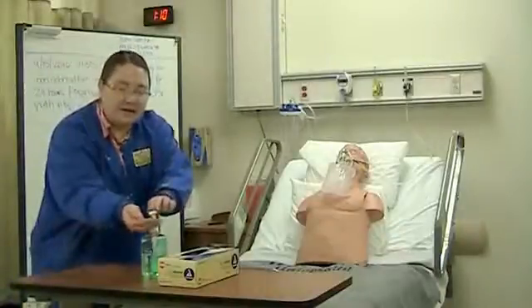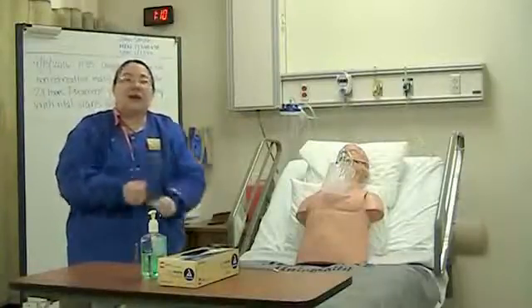apply my hand sanitizer. If not permitted at my hospital, I would wash my hands. Once my sanitizer has dried, I will go ahead and document the procedure based on my hospital's policy. This now concludes the non-rebreather mask skill competency.